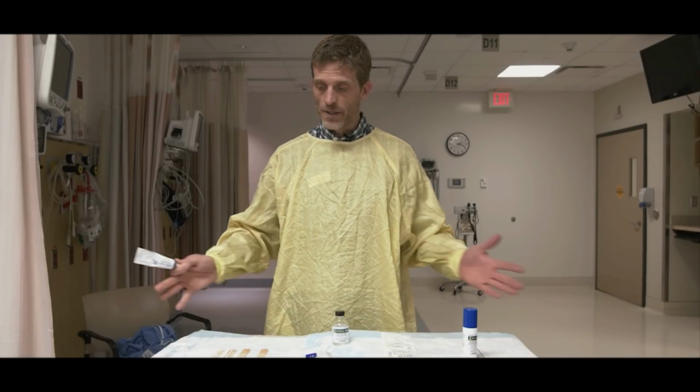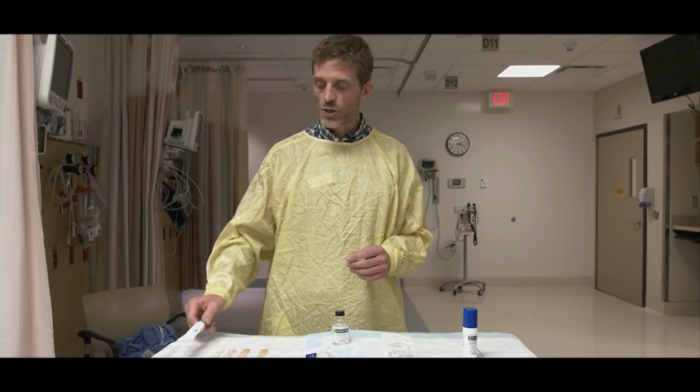You'll notice on my tray here, I actually don't have the nebulization set up. I wanted to try that just to see. My training has always been not to bother using a nebulizer at all. The particles generated from nebulization are very small and generally rain out in the lungs where we don't need anesthesia. We're trying to get anesthesia up here.